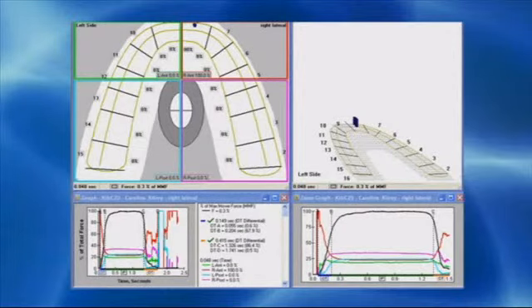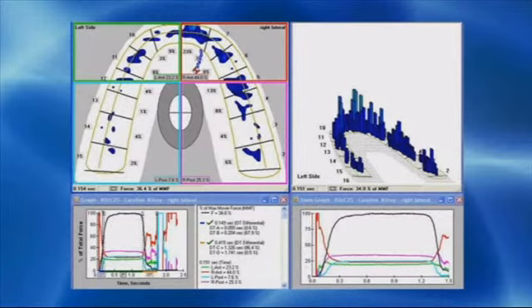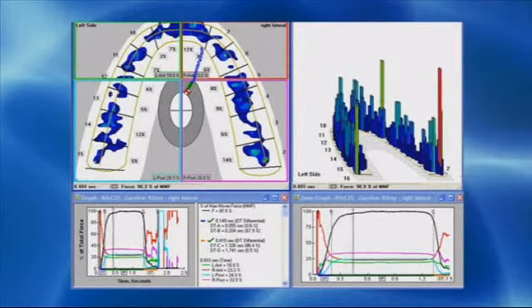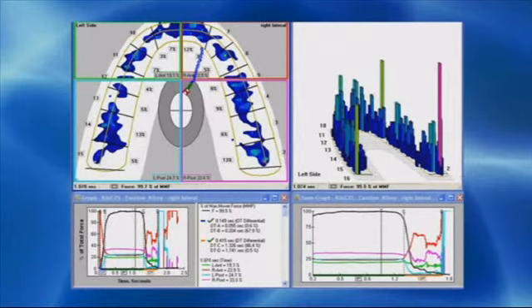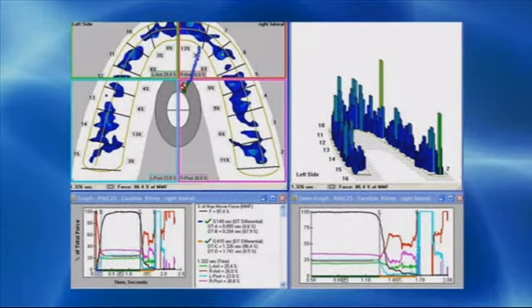So, Caroline, in looking at the data after a week, there's been the development of some anterior pressure. You can see that here, that your front teeth are becoming more forceful before the back teeth start to get into contact. So I'm going to need to relieve that. However, your center of force is still very stable. It hugs the midline, comes straight back to the middle of your occlusion, and that's a really good sign for positive closure and balance in your bite. So the front teeth I have to lessen a shade.